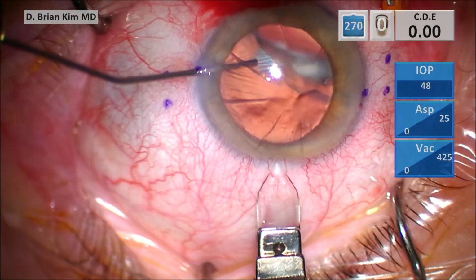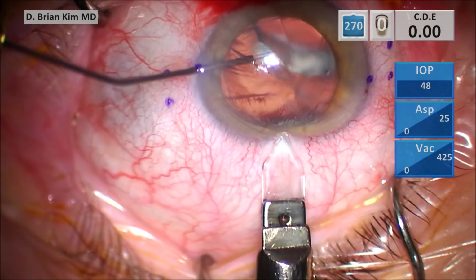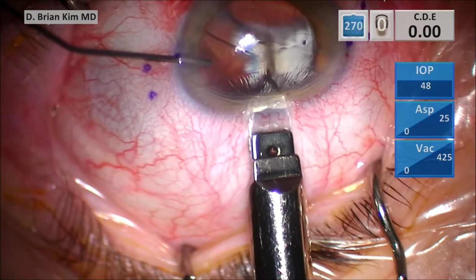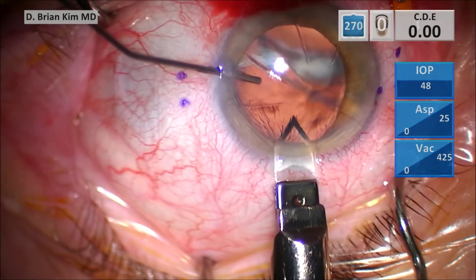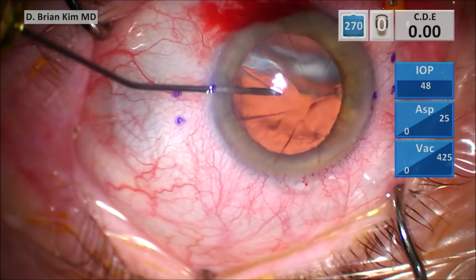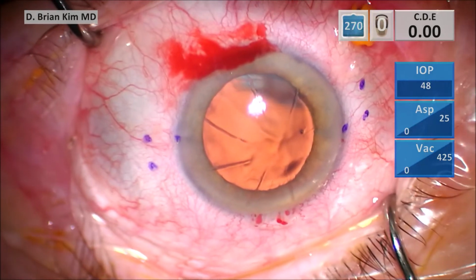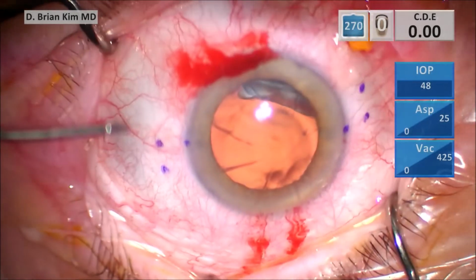And those RK marks are pretty tight. And so I'm trying to stay as far peripheral as possible. And then I enter. I'm trying not to go too anterior. I don't want to intersect those RK incisions. So now that I've made all of my incisions, I'm going to go ahead through the trocar with the vitrector.